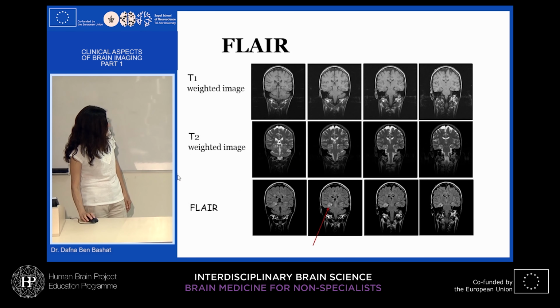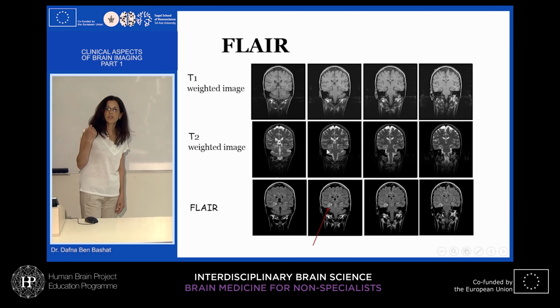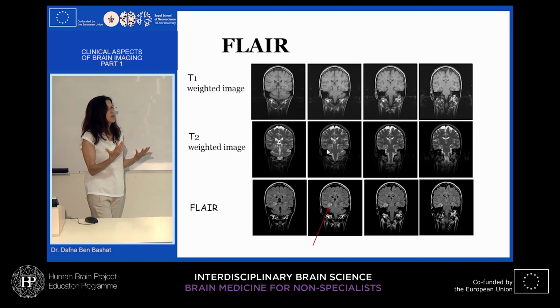Okay, and now you can see. Okay, now we can see this hyperintense area, and these are exactly the same sequences, exactly the same contrast. The reason why you see it here, if you now look back, is just our brain. We always compare contrast.